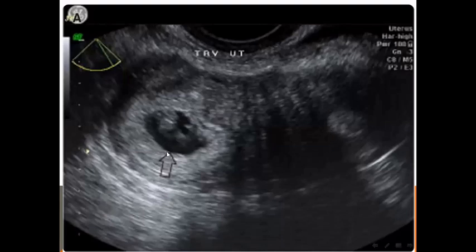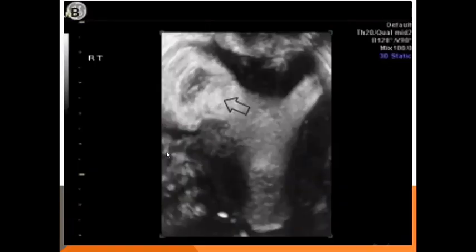By transvaginal sonography this is more obvious. By 3D imaging, this is the sac and this is the endometrial cavity. The sac is clearly separated from the endometrial cavity.